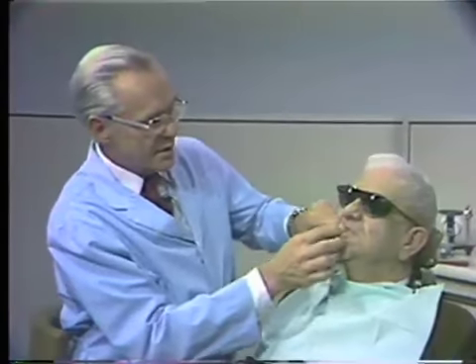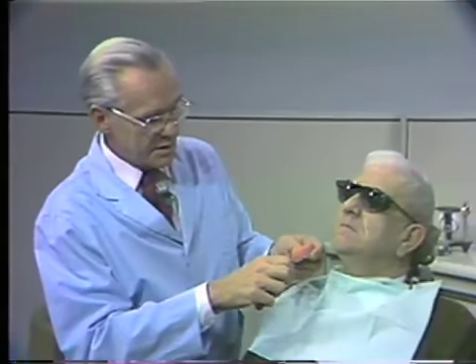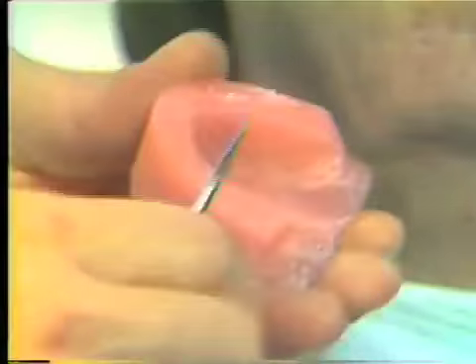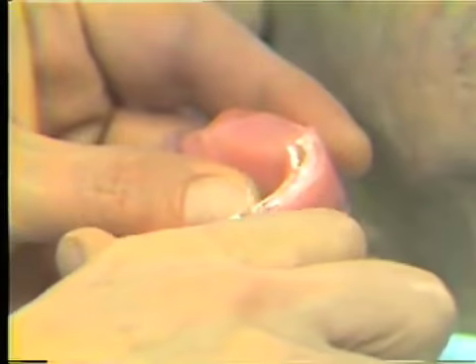So if we'll remove now the maxillary rim, and with a knife we will cut out approximately 2 millimeters from this little notch that I made posteriorly on either side, and we'll place a soft wax in a softened condition on either side.